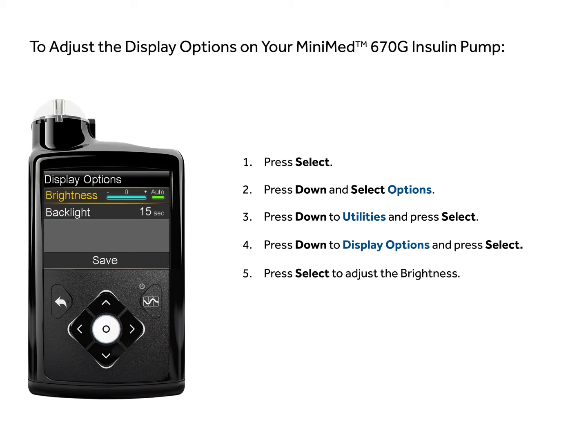Press select to adjust the brightness. Use the right and left buttons to increase or decrease the brightness. You can set a level from 1 to 5, or select auto to have the screen automatically adjust to your current environment.